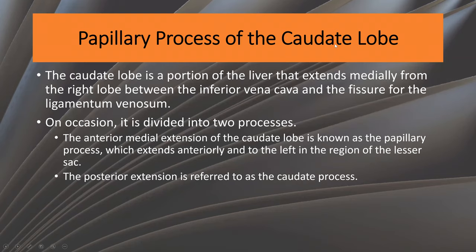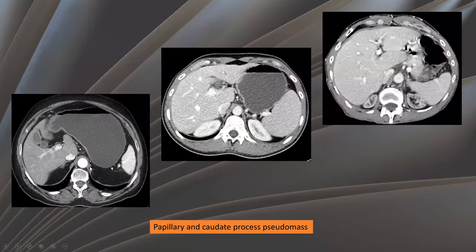The papillary process of the caudate lobe. The caudate lobe of the liver extends medially from the right lobe, between the inferior vena cava and the ligamentum venosum, and occasionally has two processes: the anterior one, which extends anteriorly to the lesser sac, and the posterior caudate process. In this patient, there is an anterior papillary process extending to the lesser sac, and here we have medial extension of the caudate lobe giving the appearance of a pseudo-mass lesion.